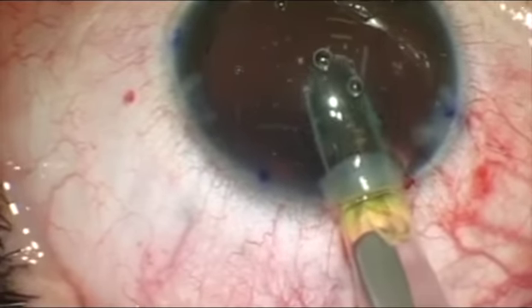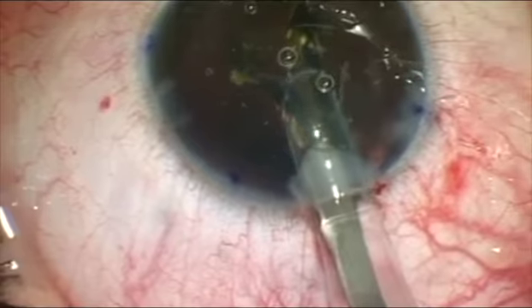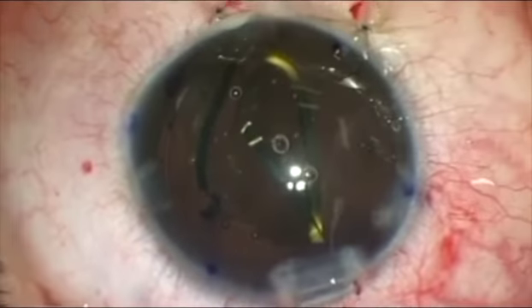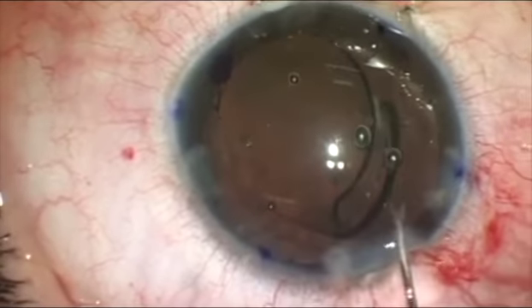Now hydrophobic acrylic IOL is inserted into the capsular bag with the help of the injector. Optical elements of that lens are positioned in place with the help of the second instrument.